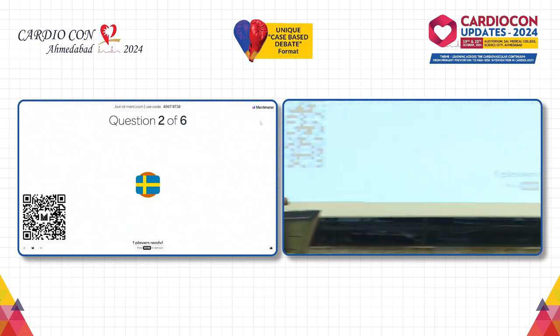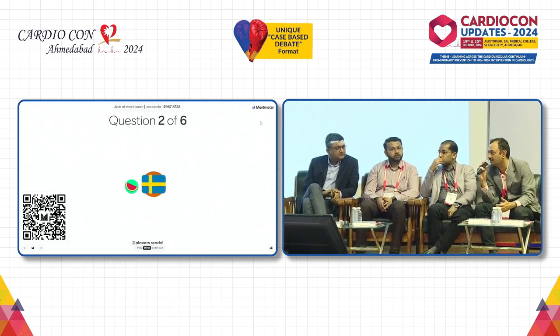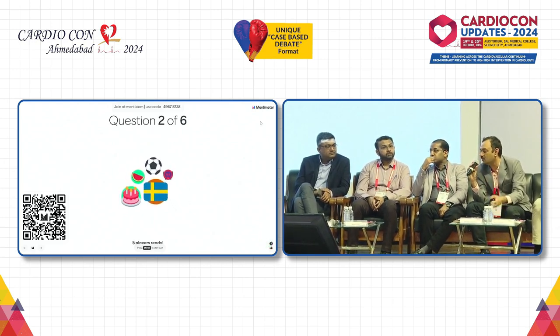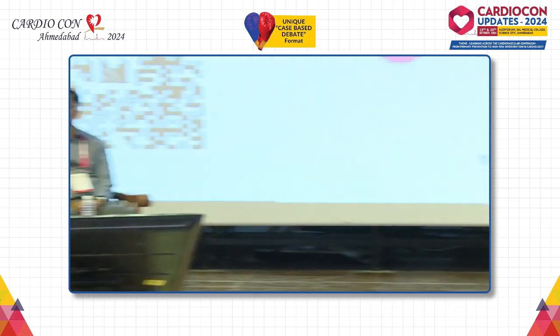There was one trial of provisional stenting which had to be converted to internal crush, and the 3-year results with reverse crush versus DK crush were equivalent. So when you are doing a bailout from provisional, and you do a bailout reverse crush, then you don't have the DK crush option. Then internal crush is the best option. I guess imaging is a must in all. Most of us don't have imaging, but imaging in these situations is a must. Yeah, I think imaging would be mandatory.